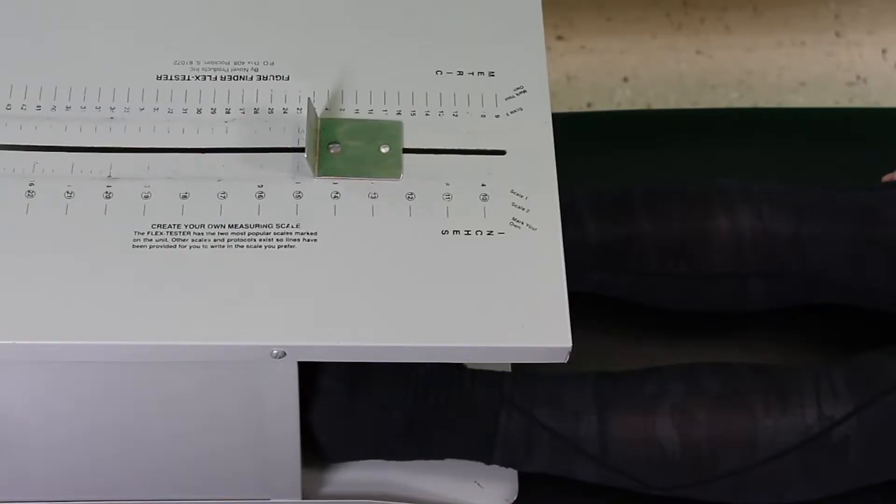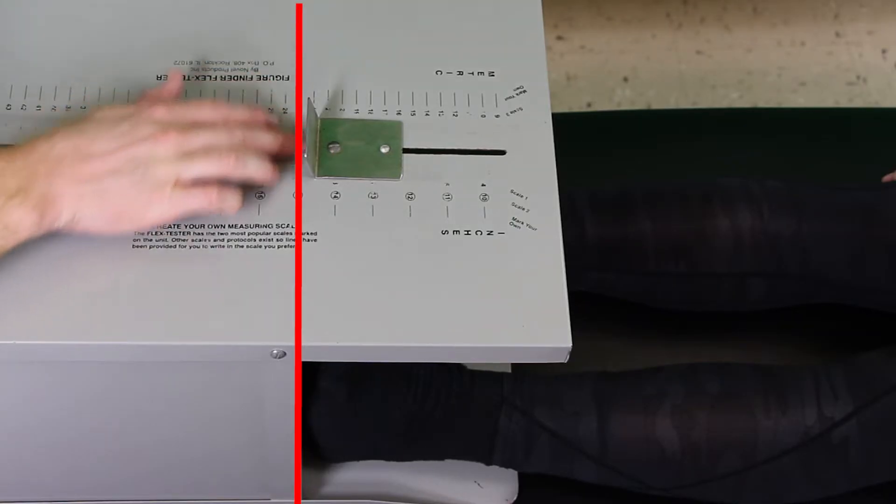Also take note of where the feet are on that scale, as it can change depending on the box you're using. The box we're using today has the feet at 23 centimeters, so anything less than 23 centimeters means the person is not capable of reaching their toes, and beyond 23 centimeters means they can reach past their toes. Make sure you know what kind of box you're using and judge scores accordingly. If you're looking at normative data, make sure they use the same type of box, or convert your numbers to match the box that normative data was created for.